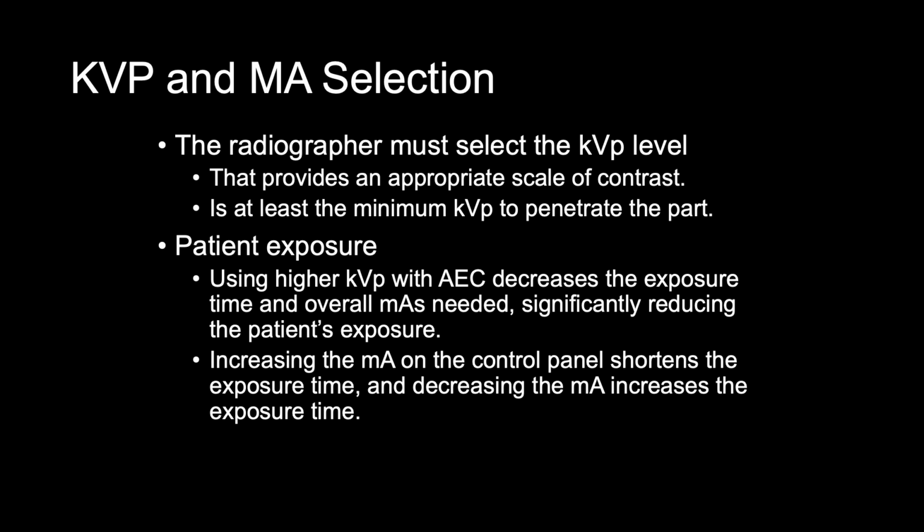The radiographer must select the kVp level that provides an appropriate subject contrast and is at least the minimum kVp to penetrate the part. Contrast can be computer manipulated in digital imaging. The kVp should still be selected to best visualize the area of interest.